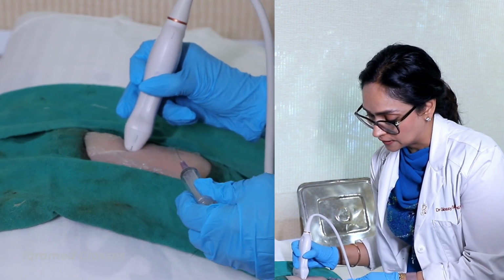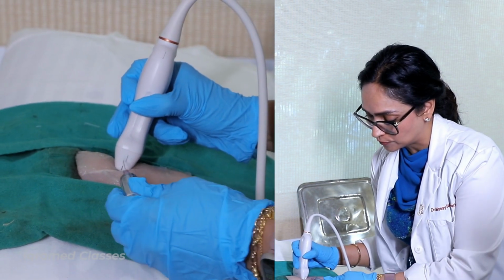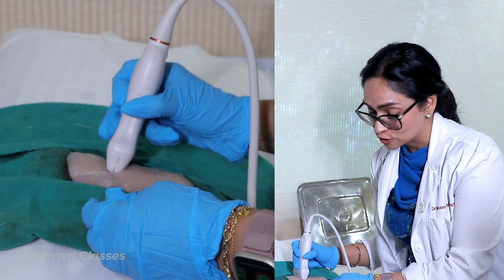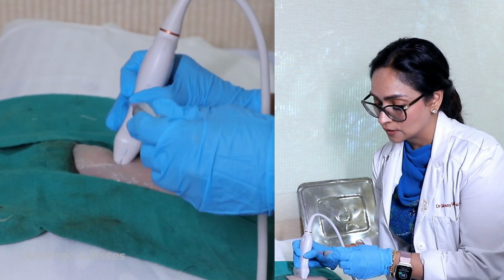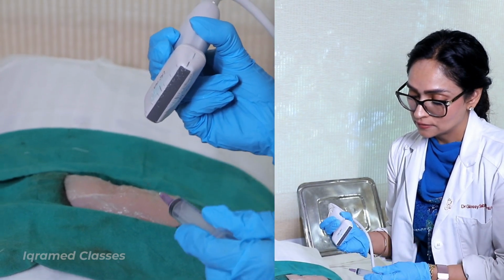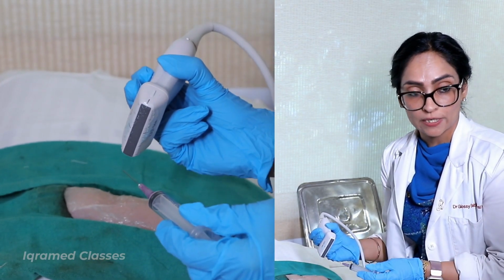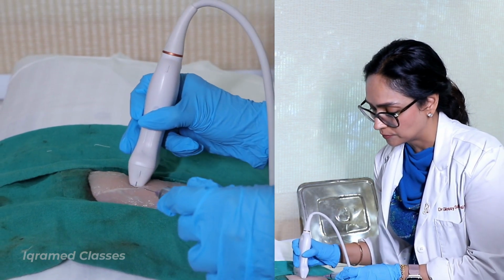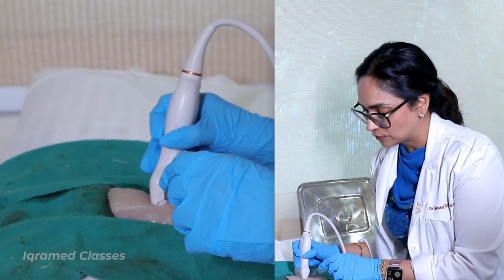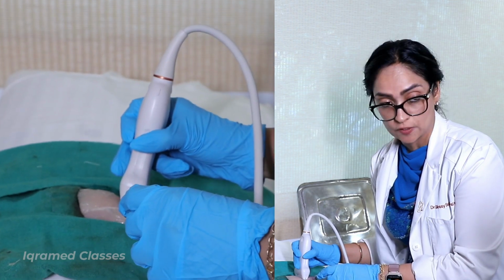Look carefully. This is my transverse position of the probe. I'm going to go like this so that I'm parallel, making sure that I am not touching the probe also, otherwise it will spoil it. Any sharp object will spoil the probe. So we have to be careful that way, but we have to keep it as much parallel as possible.